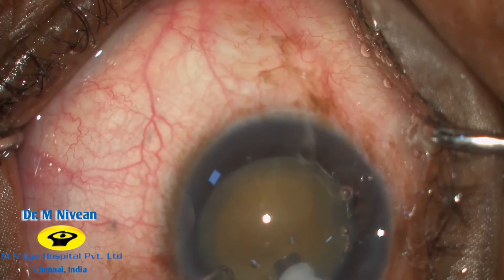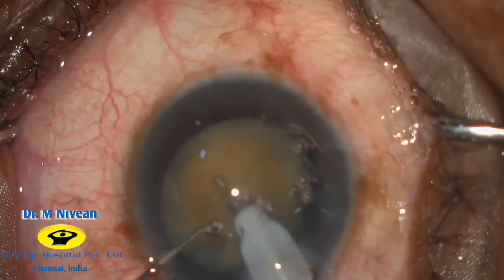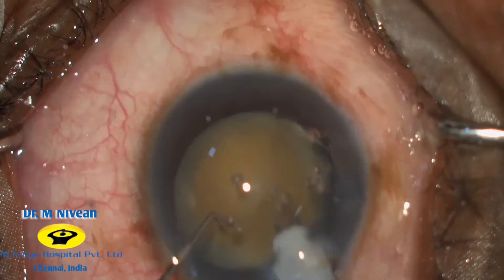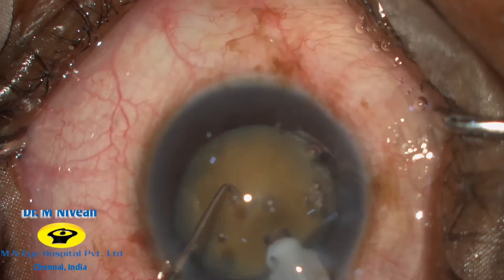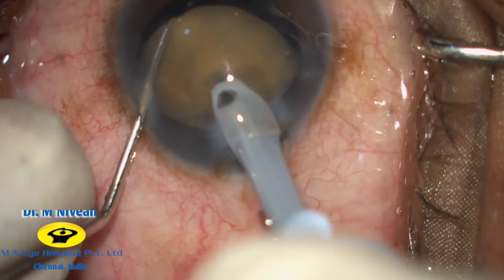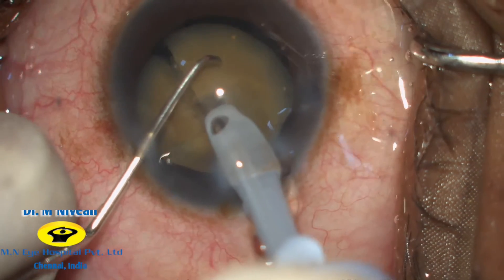In FACO-1 mode, small trenches are made in the superior part of the nucleus so that a crater-like impression is created. By burying the FACO probe into the nucleus, a terminal chop technique is performed to complete the crack.